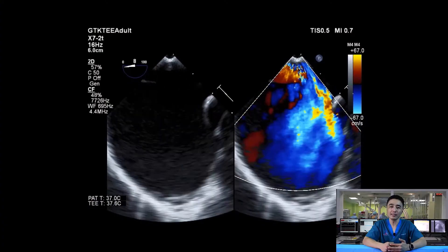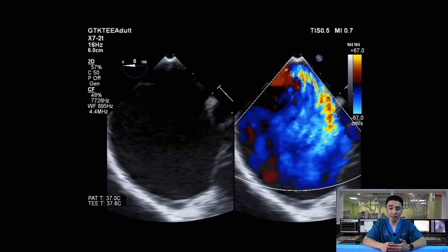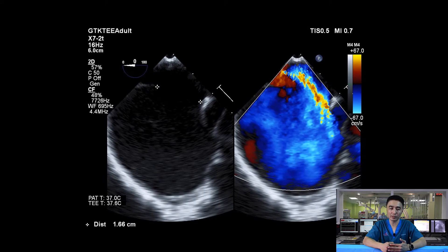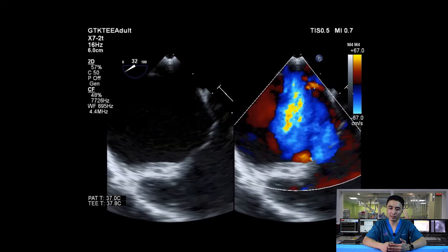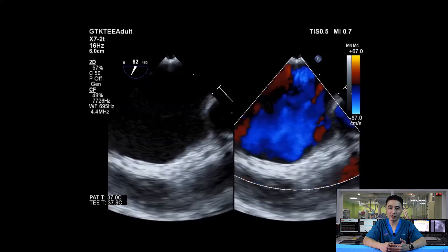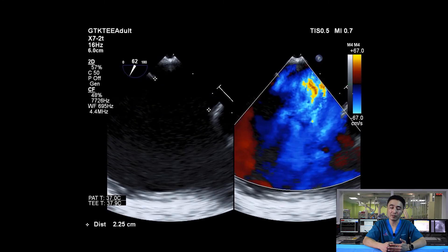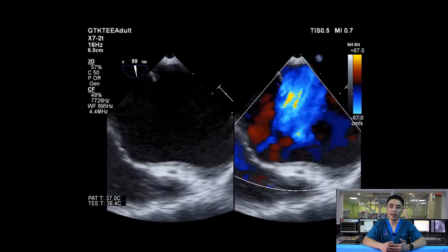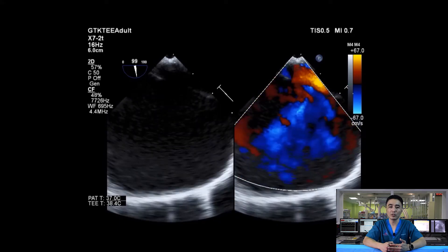Let me show you a case of a 7-year-old girl weighing 20kg with a large secundum ASD. On TEE, it shows significant left-to-right shunting, measuring about 16.6mm at zero degrees and 17mm at 30 degrees. The 60-degree view shows the largest defect measuring 22.5mm with significant shunting, likely underestimated in this view. By bicaval view, it measures about 22.2mm.